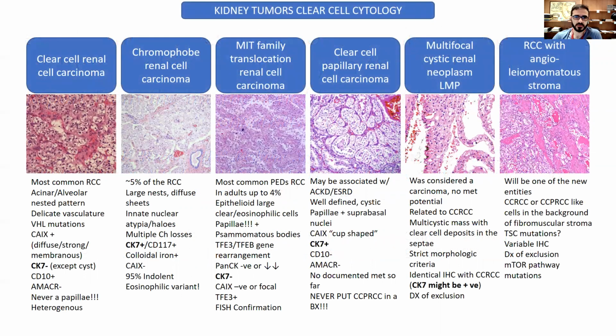When we think about kidney tumors with clear cell cytology, we have a relatively limited set of differential diagnoses. And a morphology-driven approach should be the primary thing. I'm not going to go over the information that is written here, but I'd like to go over 4 questions with their answers with you. And I think by answering these 4 questions, it will be very easy for you to tackle most of the kidney tumors with clear cell cytology.